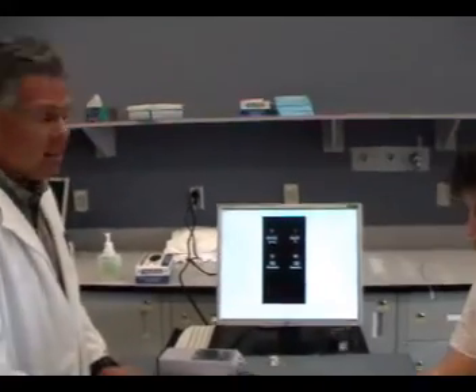Is that okay? Your doctor wants to do that because he wants to assess your oxygenation status — see how well you do on room air. So my doctor wants this done? Yes, he does.